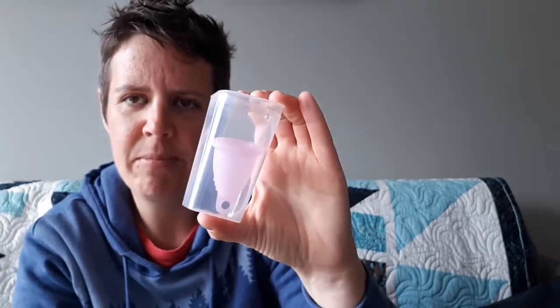And then also there is this box. It's kind of like the Yuuki cup's infuser box, which you can use to deep clean your menstrual cup in the microwave. The way it works is you put it in there, put some water in, put that on top, and then microwave it for a couple minutes — that is a way to deep clean your menstrual cup.